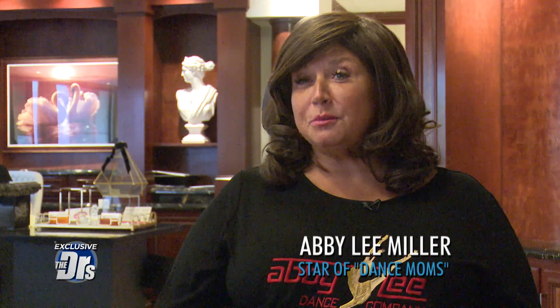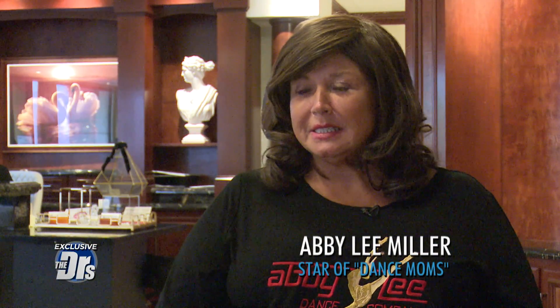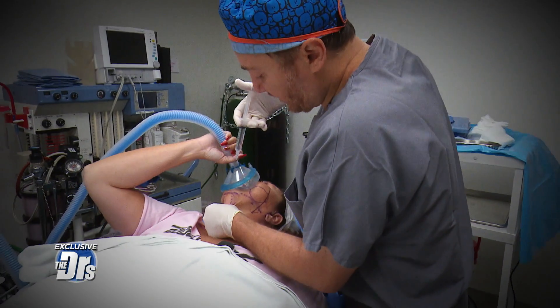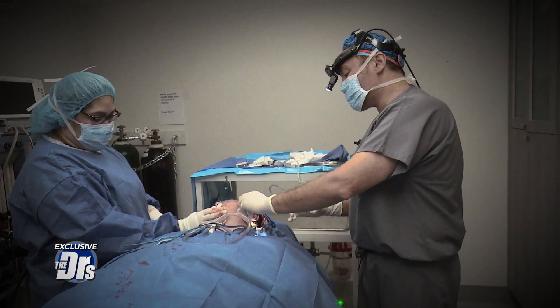Today, I'm here at Dr. Simone's office in Beverly Hills for a facelift. And I'm scared. We're going to do a Simone facelift using human super glue. I don't use major anesthesia, so Abby doesn't have to go under major anesthesia. We put sutures underneath the skin to lift and support. I use that human super glue, so everything is closed and sealed. I just don't like needles. I'm freaking out just with the pegs.